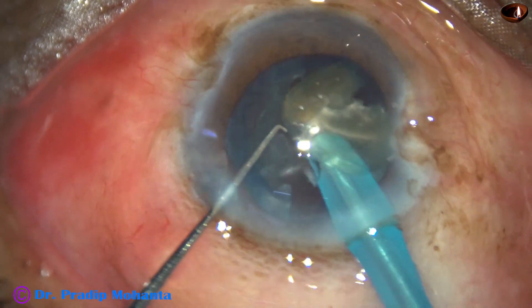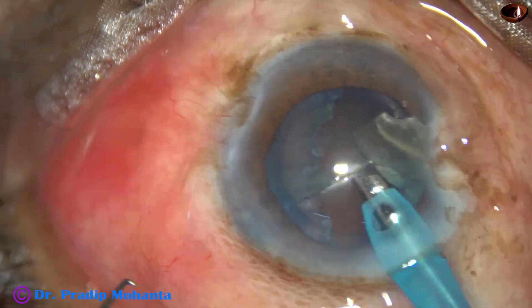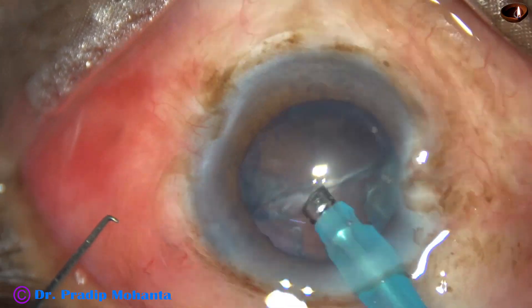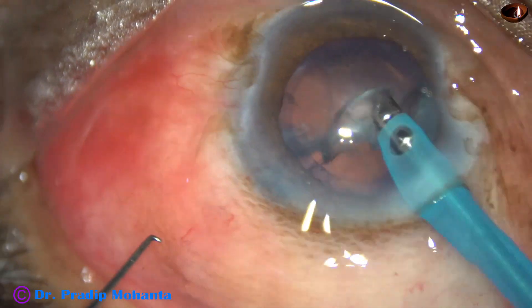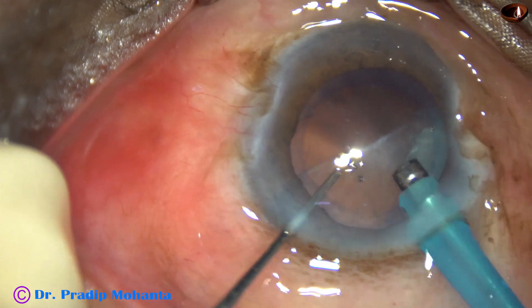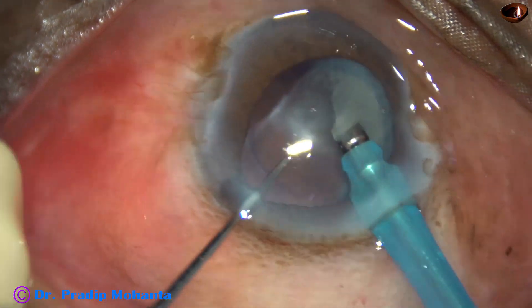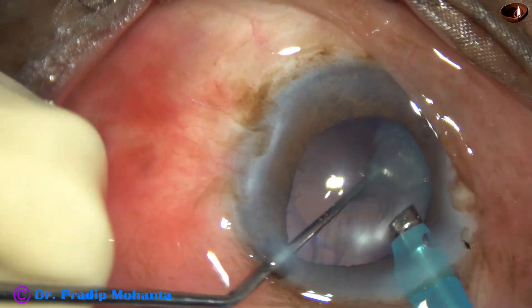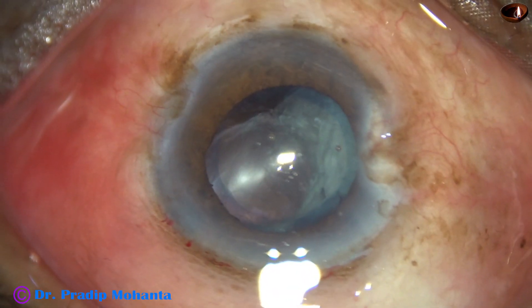As I come to the last piece, the vacuum is reduced to 250 and flow rate to 25. There is a thin sheet of epinucleus. This is the most tricky maneuver. Unless we lift this sheet of epinucleus, if we try to catch it when it is in close proximity of the posterior capsule, we can rupture the posterior capsule.